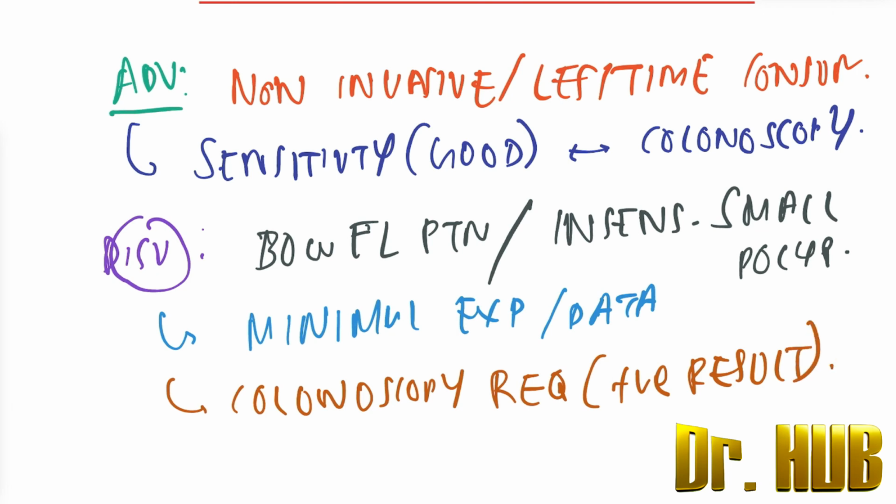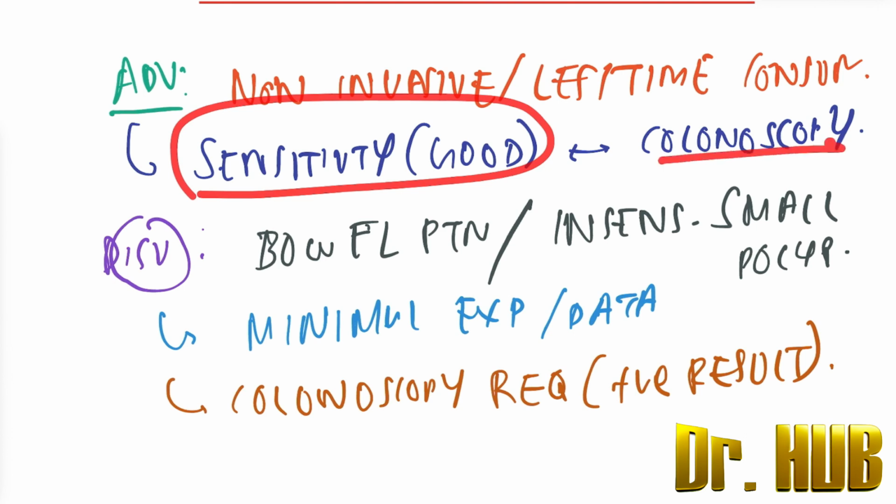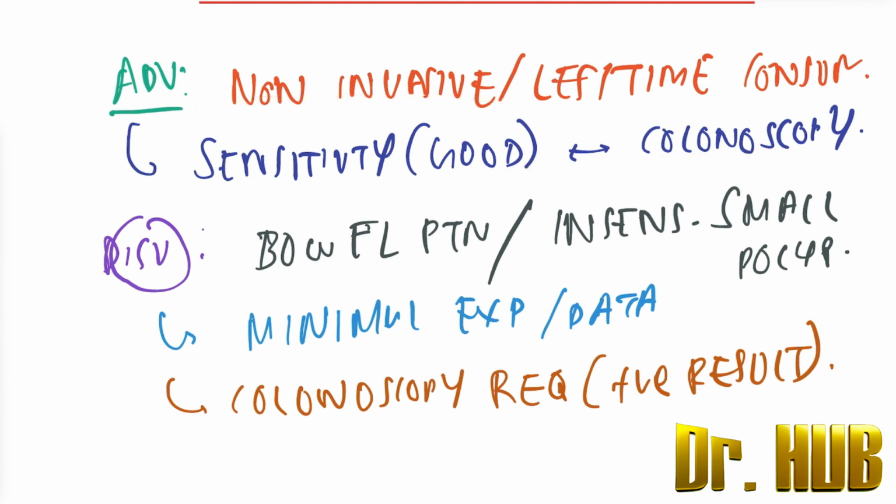So the advantages, let's recap. It is non-invasive as well as less time consuming. The sensitivity is as good as colonoscopy. The disadvantage is that bowel preparation is required, and it is insensitive for small polyps. There is minimal experience and data. And colonoscopy is required for a positive result.